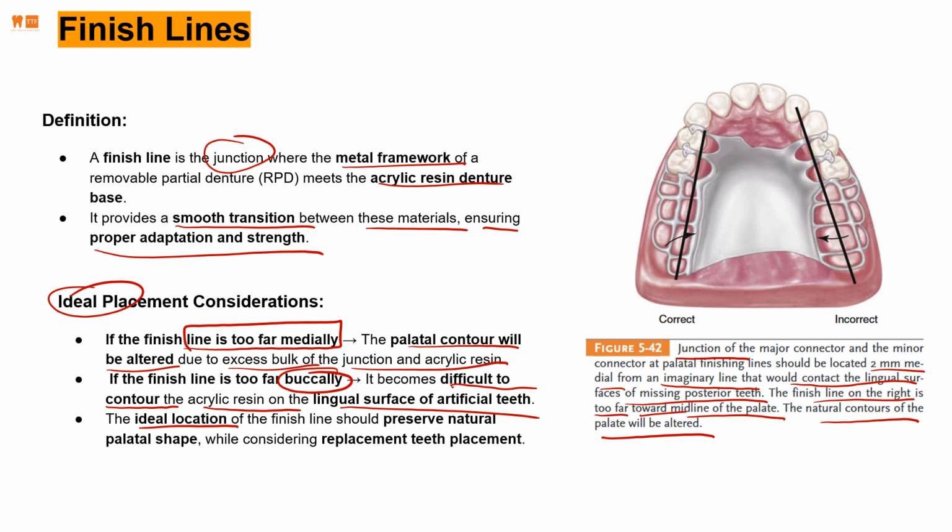So ideal location is to preserve natural palatal shape. So when we replace teeth, say I want the tooth here, I want the tooth here, it just needs to end in this section here. That could be the finish line.